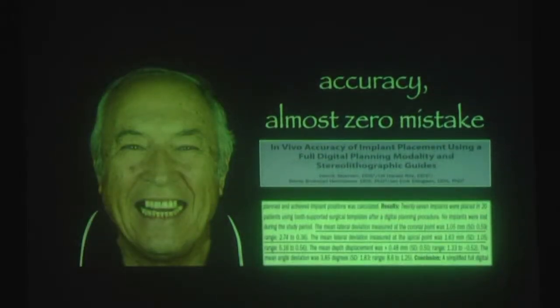Yes, accuracy is the most important part of guided surgery. So I have to remember one scientific paper telling us that the deviation of guided surgery is 1.3 millimeters to 1.6 millimeters. It's about data collection.